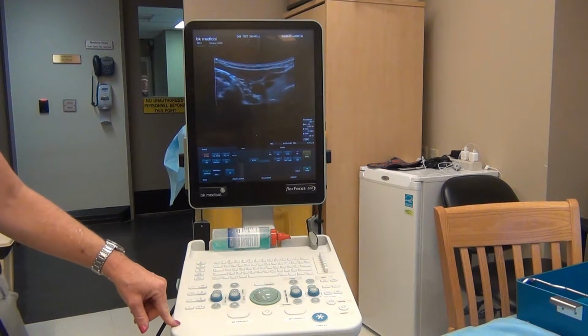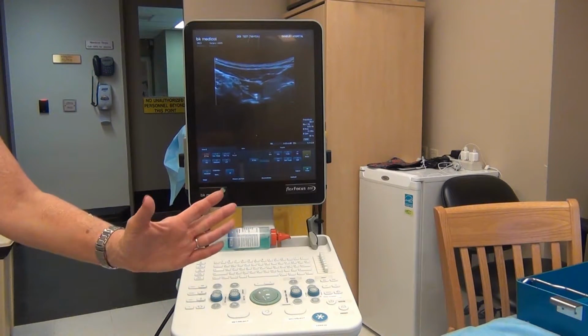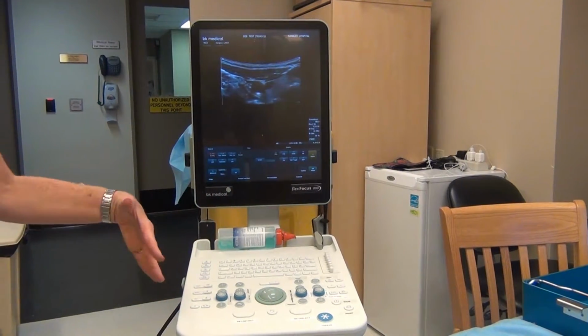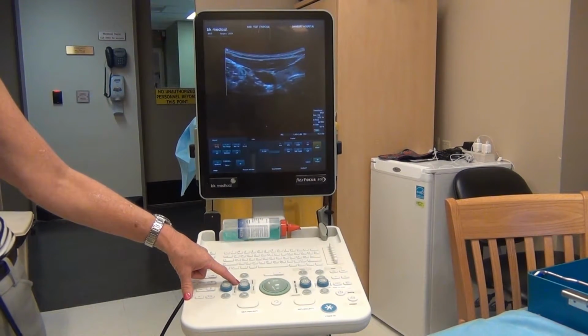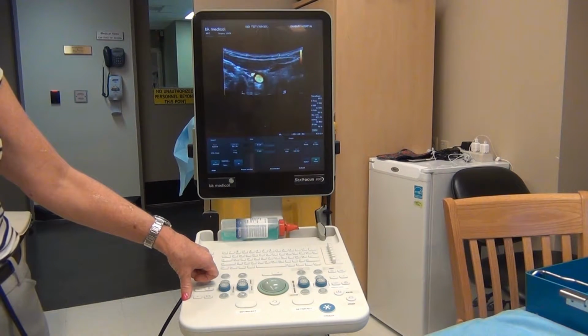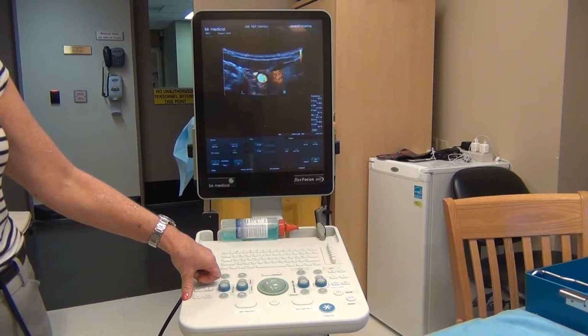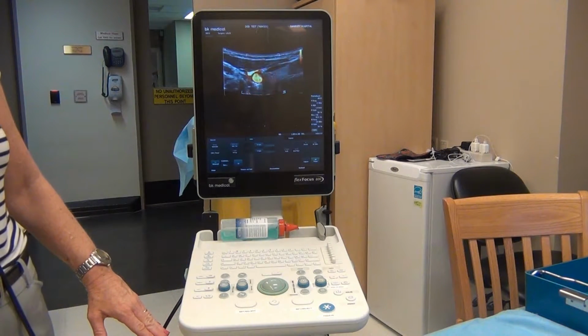To get out of that, you can push color to get out of it. Okay. Now say I wanted to just see if something was vascular. Color is for direction of flow. If I just wanted to see if something was vascular, I can hit the power Doppler, which is just going to tell me yes, it is vascular. So if I hit P, it's a different color map. It's an orange.